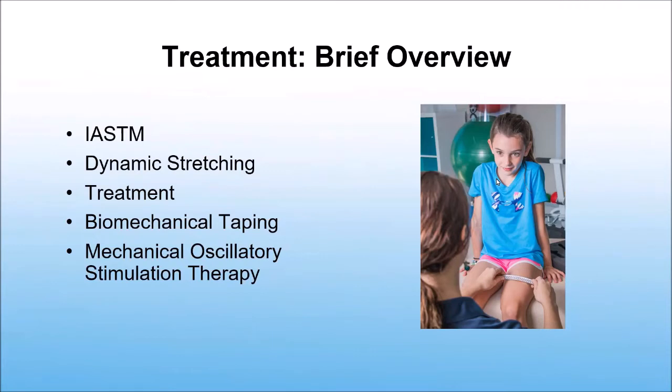So with a biomechanical tape, you place it in a shortened position, and again, it's like a bungee cord. If you're using something like kinesiology tape, it has about grams worth of strength. This has kilograms of recoil. So if you put it in a shortened position, think of what you do with a bungee cord. As someone moves, it's going to absorb the load, like a squat. They're going to squat down, it's going to absorb the load out of the knee joint and around the knee joint, and then when you pop back up, it's going to take that potential energy and spring it into your movement.